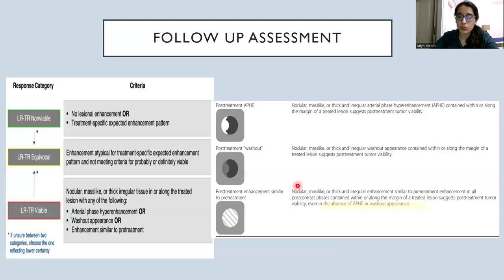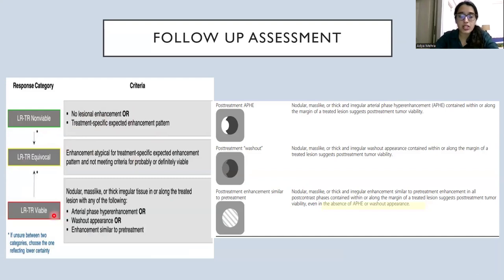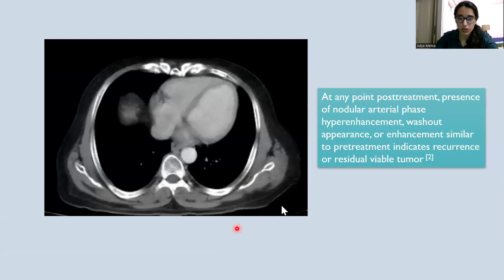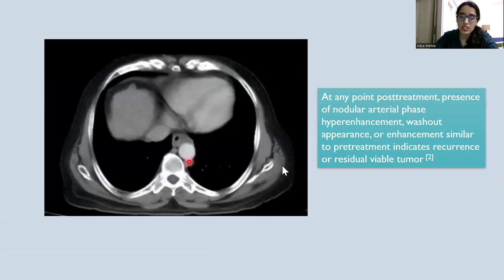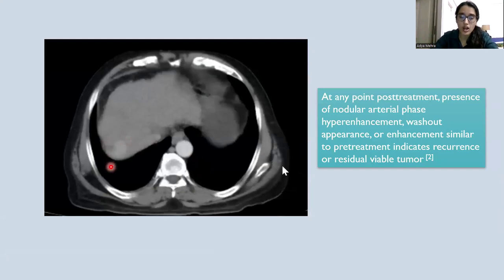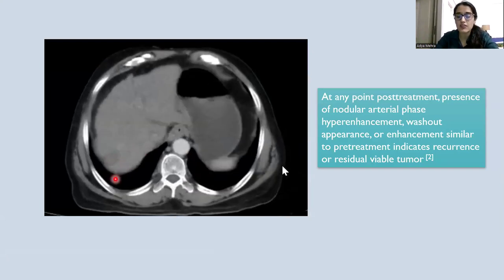Follow-up assessment is done based on imaging characteristics and criteria defined by the LiRADS treatment response system. Non-viable is when the tumor has no lesional enhancement or a treatment-specific expected enhancement pattern is seen. When the lesion does not meet the treatment-specific pattern or viability criteria, it is called equivocal. The tumor is viable if at any point post-treatment there is nodular, mass-like, or thick tissue along the treatment zone showing arterial-phase hyper-enhancement, washout appearance, or an enhancement pattern similar to the lesion pre-treatment — as seen in this case with nodular arterially hyper-enhancing tissue on follow-up.